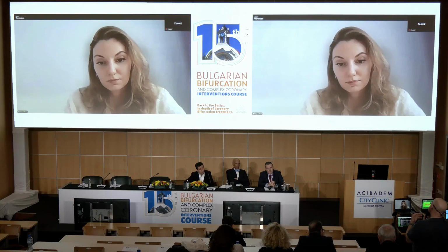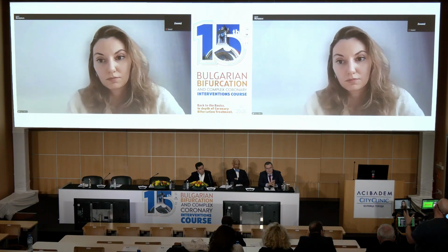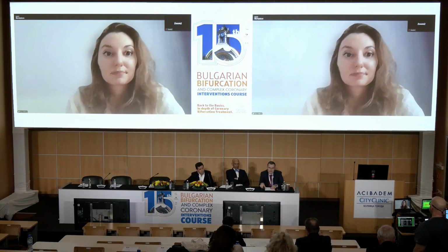And this is the conclusion to which we came with Professor Kirova, because we are doing quite a lot of CT for coronaries for different reasons, especially electrophysiology, but coronaries. And we were running down the stairs, coming back, to see what's going on. And she said, okay, the best way is to have the station at the cath lab, and someone who is a little bit proficient in, how to say, management of the images.